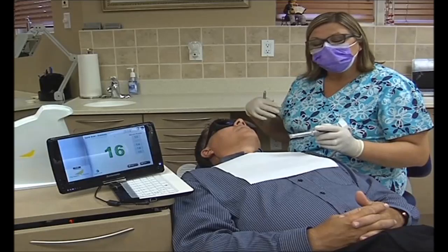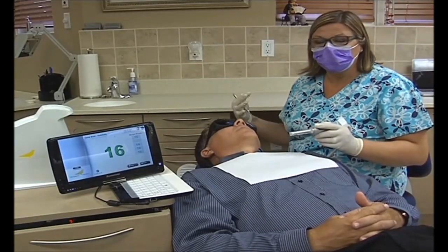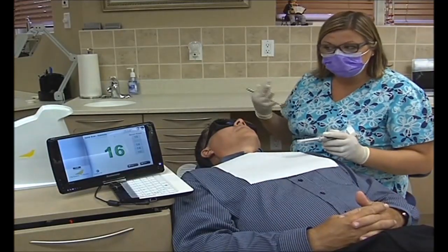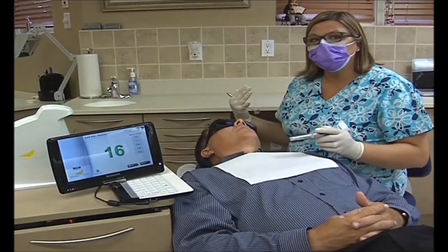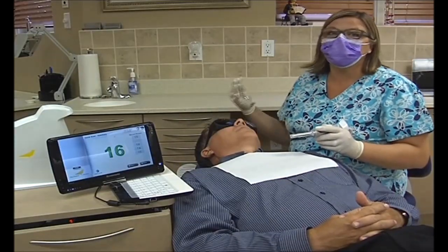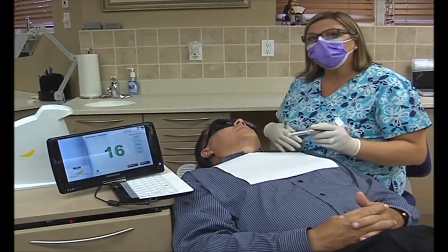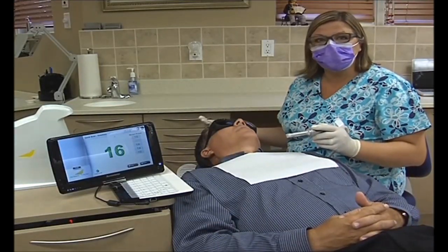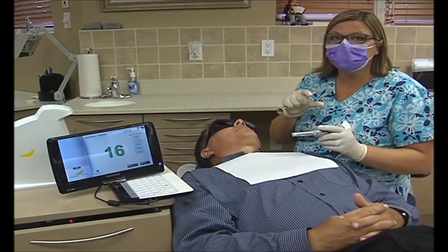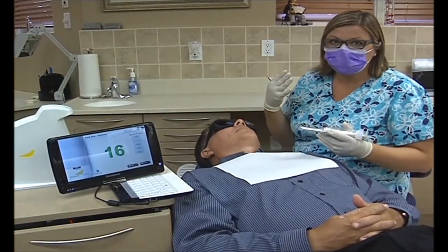Now I'll show you a detailed scan. When we want to do a detailed scan, we put in the patient's information — name, age, male or female, and their postal code. That's all the information you have to input. The computer holds that information so that each time the patient comes in, you'll see what you've done the last time. So if you're monitoring for decalcification, you have a baseline. When you go back to that tooth and re-scan it, the computer will show you a small picture of the tooth you scanned last time with the numbers you were getting, so you can compare the difference from the last scan to this scan.